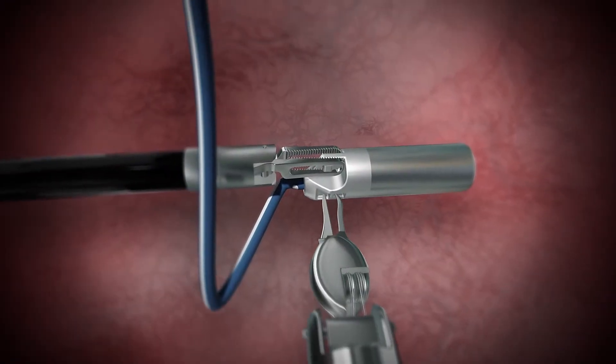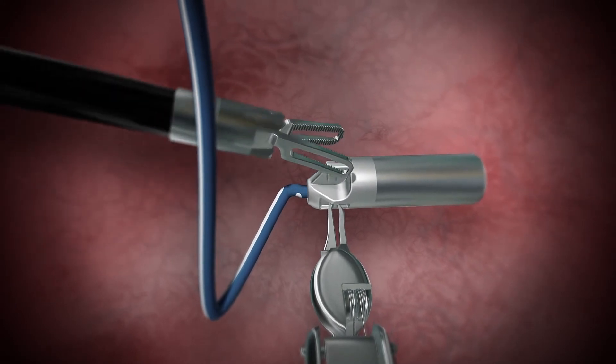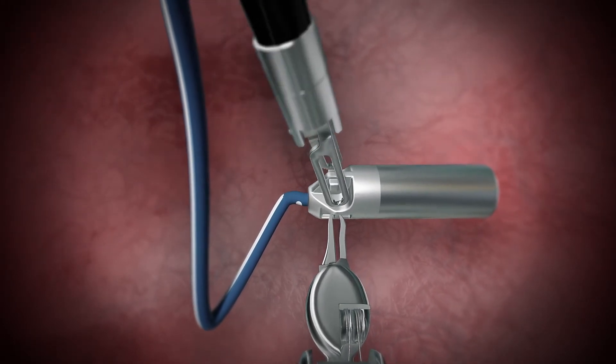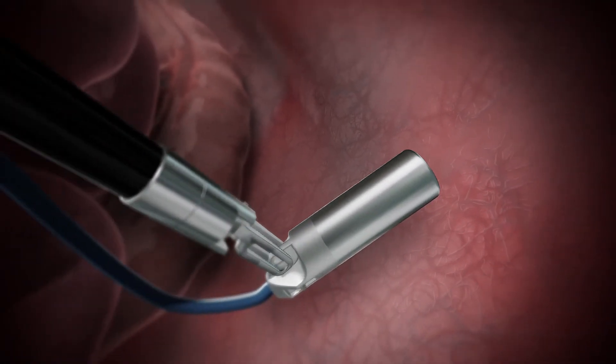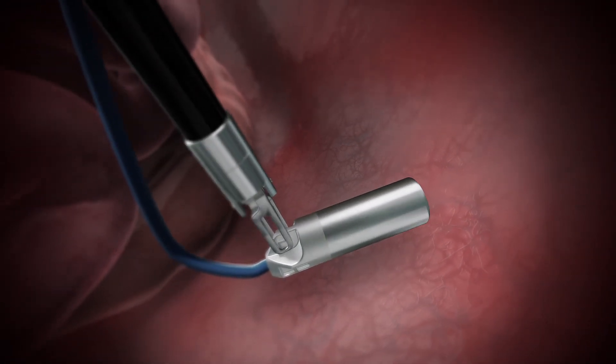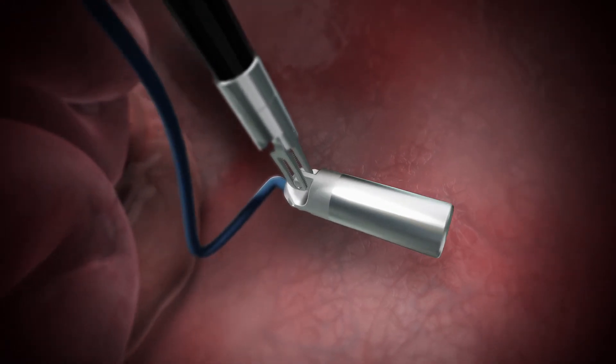The probe's side pockets provide a safe location for needle drivers to grip and reorient the device quickly. With articulation through six degrees of freedom, surgeons can navigate complex anatomical locations with ease and confidence.